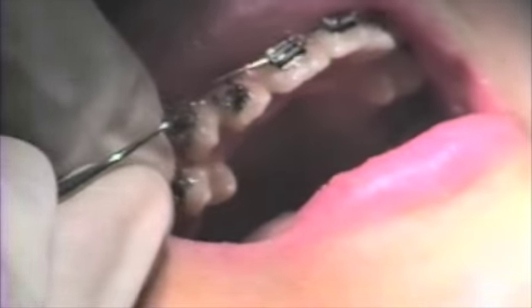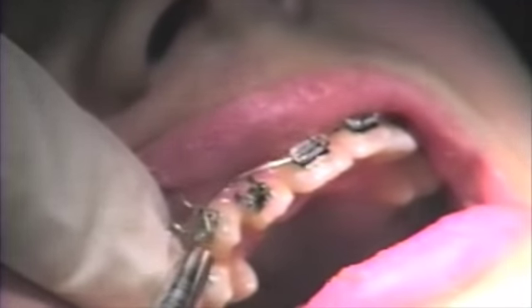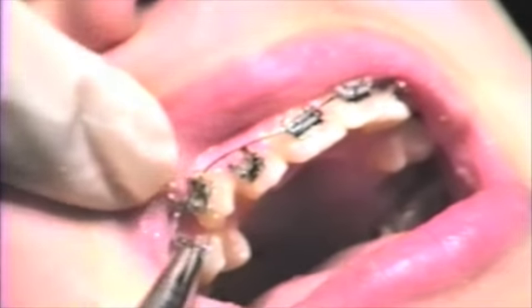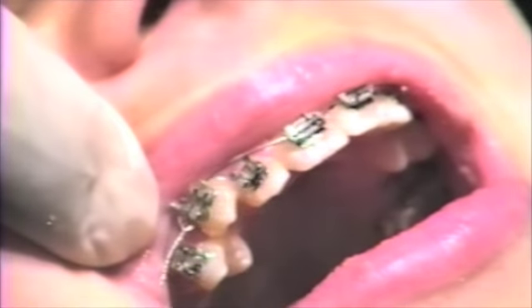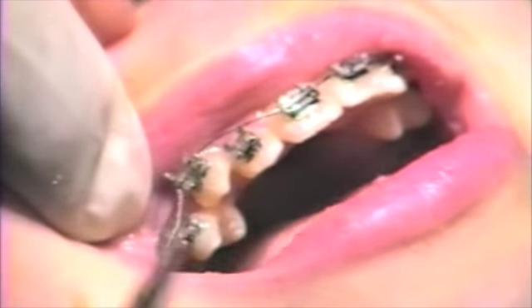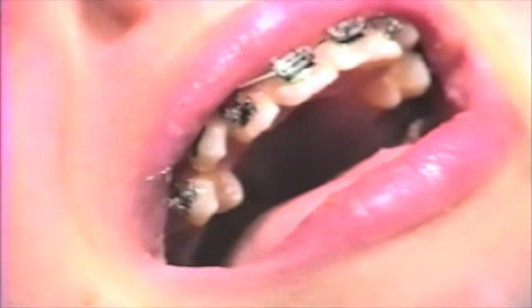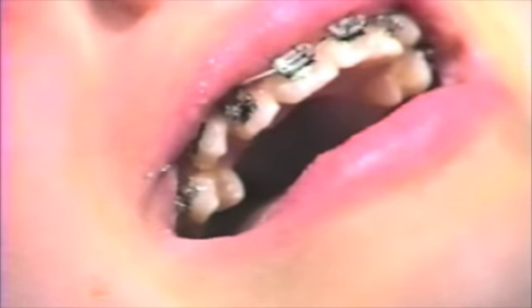Now let's observe the first tie-in on the patient seen earlier in the video. We'll use a standard four tie-wing tie using a Shorty Twistmate system. The ligature wire is not quite as durable and seems to break easier than the other O10 ligature wire used. Also, the short ends require more frequent cutting and tucking due to discomfort to the lips. The short wire ends can also be lost easier, causing damage to the office vacuum cleaners. But most prefer the one hand twisting with this instrument.